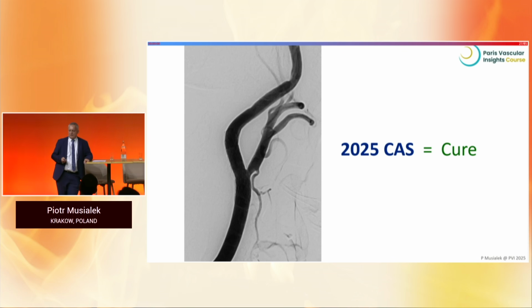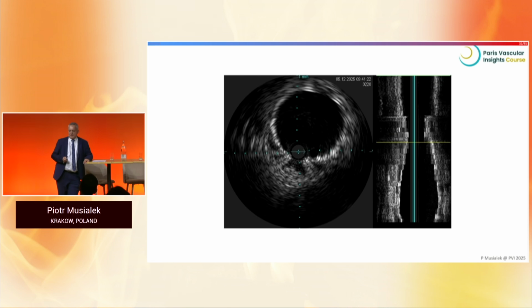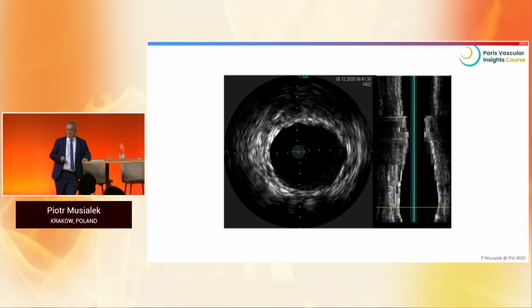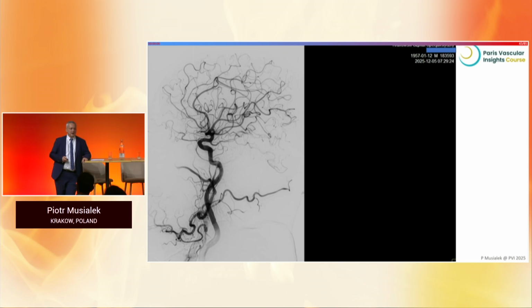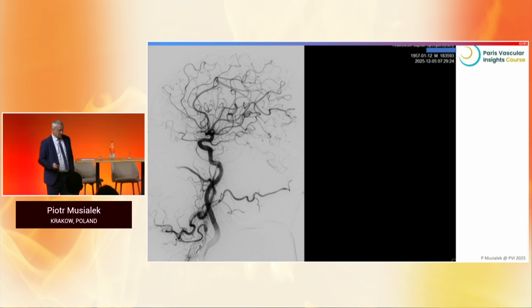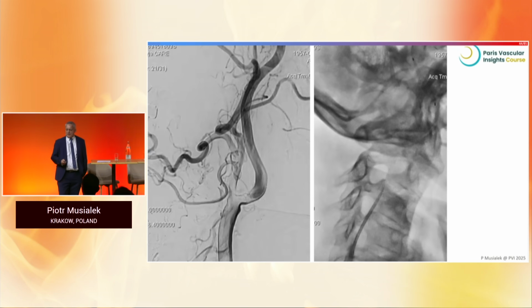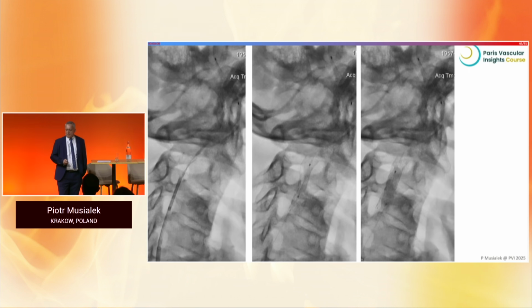So in 2025, I believe we can cure the patients with this technique. This is IVUS in this patient, just to show you that the effect, I hope, resembles the effect of endarterectomy of Professor Rantner, except that here you don't even see where the stent is. This is just one patient chosen from a week ago. These are the intra-procedural images for you. You can see where and how you position your stent.